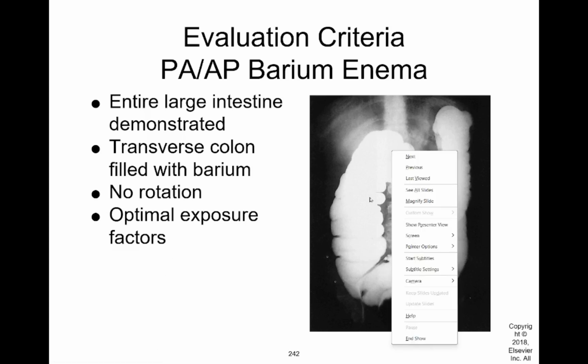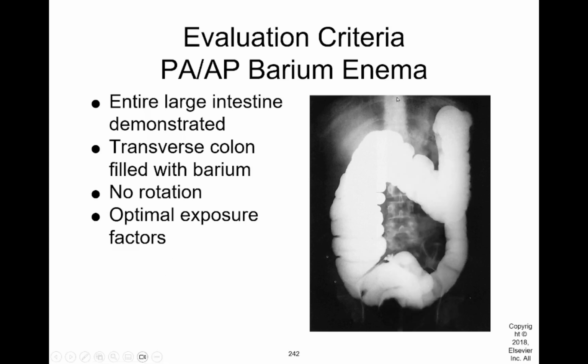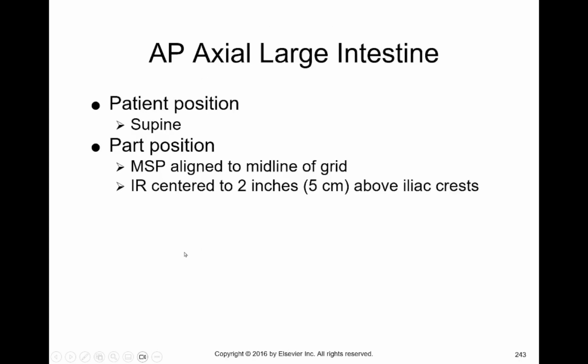So this is what we should see. We've got the vertebra in the middle. You should have been through vertebral positioning by now, and KUBs as well. So what you should know is that is the spinous process, and it's right in the middle of the vertebra. We don't have any kind of rotation there. That's a good image. It shows the entire colon, everything that we want to include. It's a little dark, though. I would question if they used 110 kVp or above.